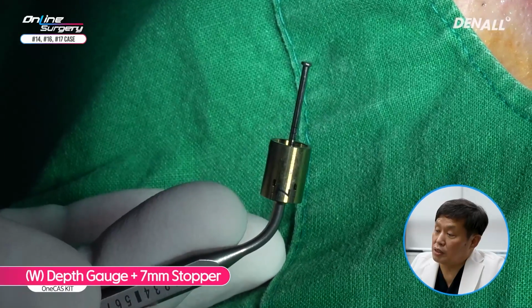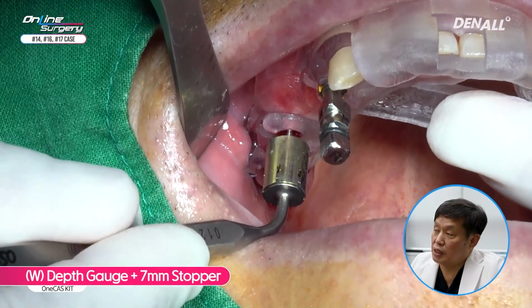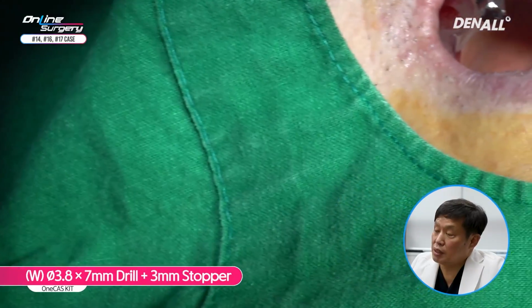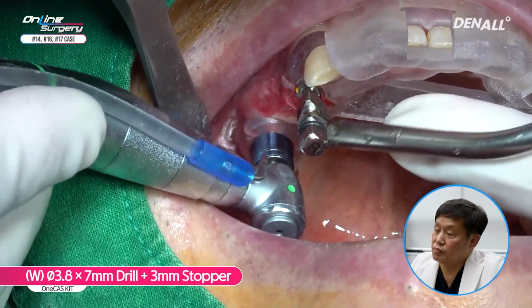In order to check whether penetration occurred, the depth gauge with 7 millimeter stopper was used. So you can see that there's no contact here. After that, a 3.8 by 7 millimeter drill with a 3 millimeter stopper was used to drill up to 4 millimeters.